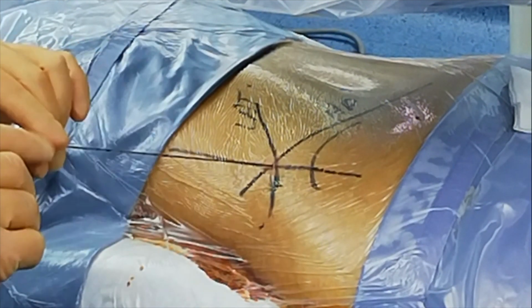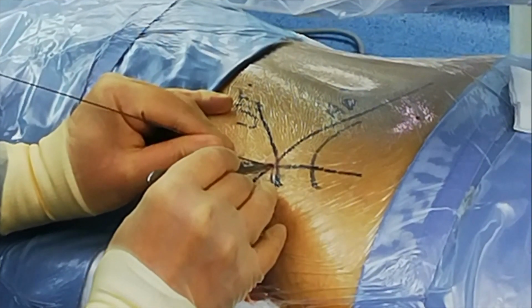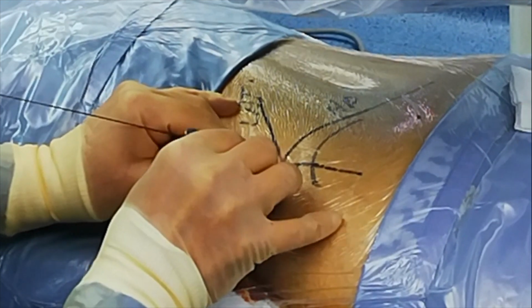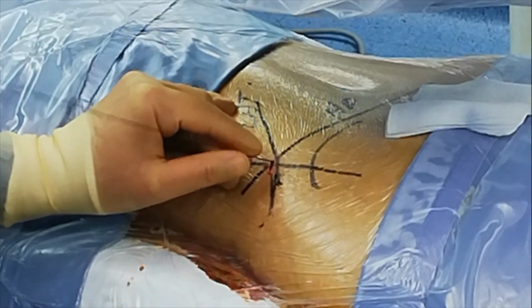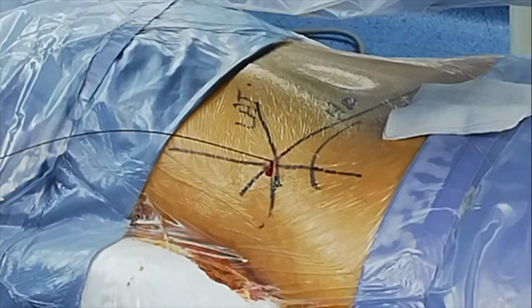And remove the needle. And we do the skin incision now. All we need is 0.5 centimeter to 7-8 millimeters only, a little bit deep just to open up the fascia, and that's our skin incision for TELD. And we go for the first guiding rod, please.